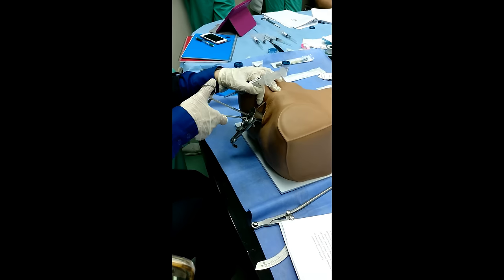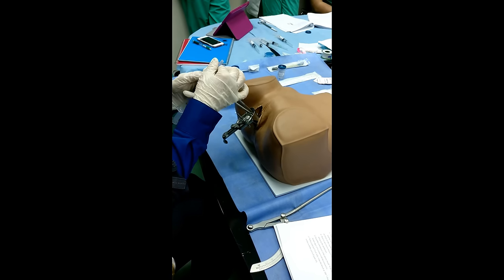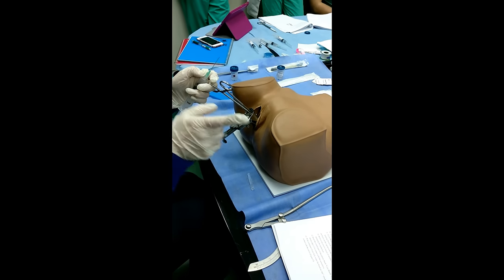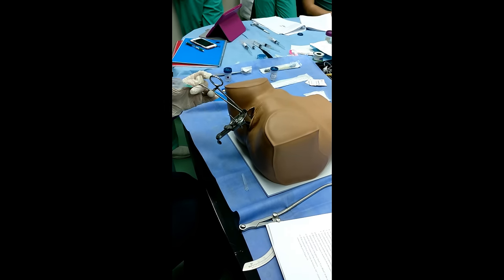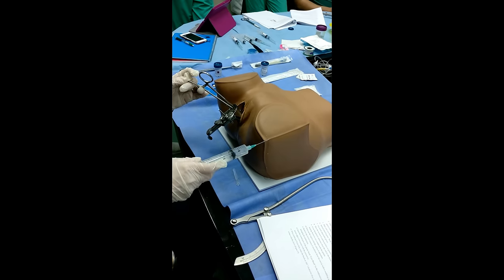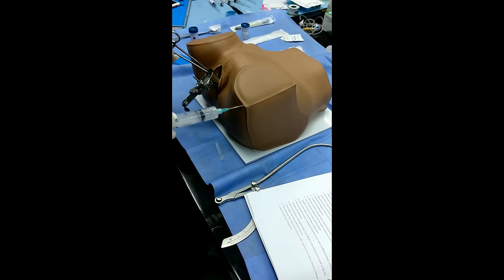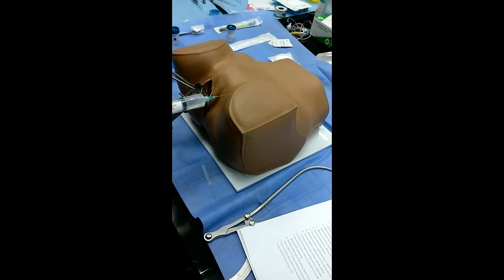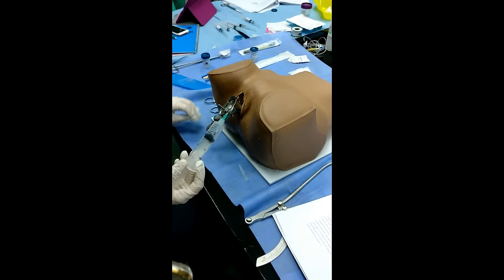After fixing the cervix, we will perform anesthesia in 2 lateral and 1 inferior point. We go laterally, parallel to the cervix. We introduce, we retract to verify that we are not in a vessel, and we introduce lidocaine. The second is to the left, the same, parallel to the cervix. We retract and we introduce. And at 6 o'clock, inferiorly. After that, we wait for the analgesic effect and we start the procedure.